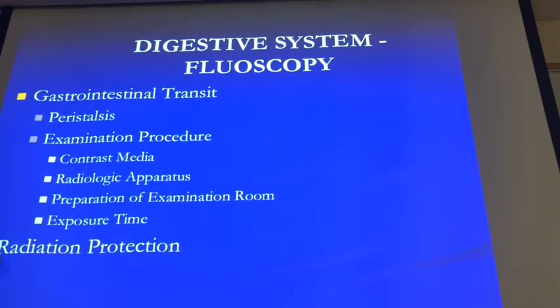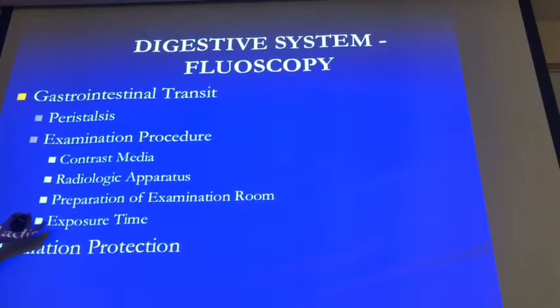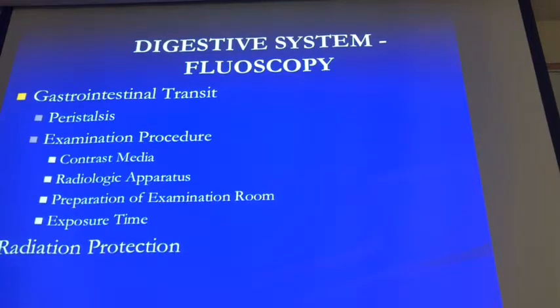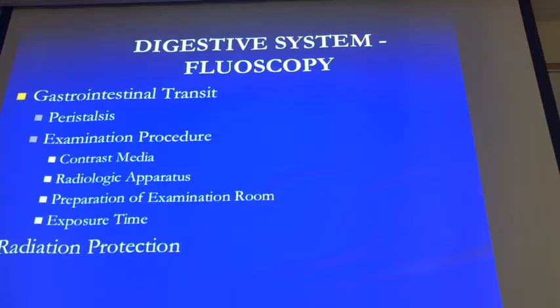Anytime you're doing fluoroscopy, you have to have a lead shield on you. Why? Because of time. Time in fluoroscopy is not measured in milliseconds like when you're doing plain x-rays. When you're doing plain x-rays, your exposure time is typically milliseconds or maybe centiseconds, so it's very short exposures. In fluoro, you're measuring in seconds or minutes, and so scatter radiation will be more abundant. Also, because of the technical factors that you have in fluoroscopy, scatter radiation is abundant. And so you have to protect yourself.